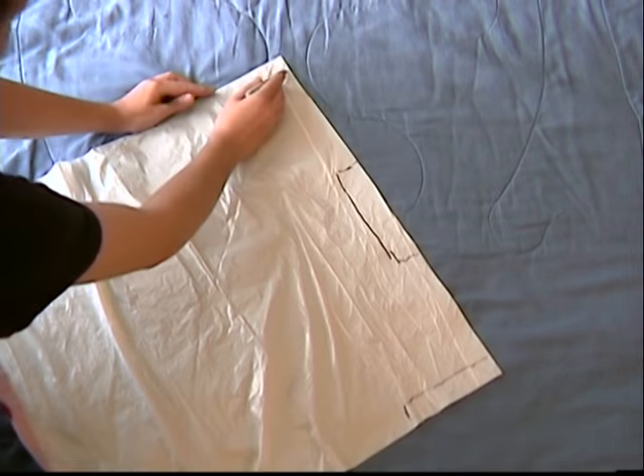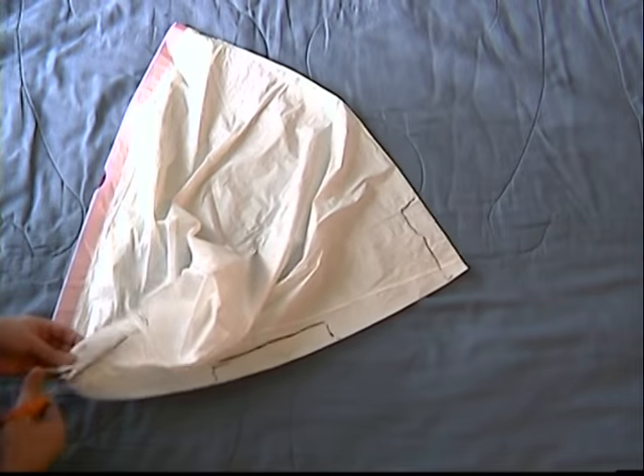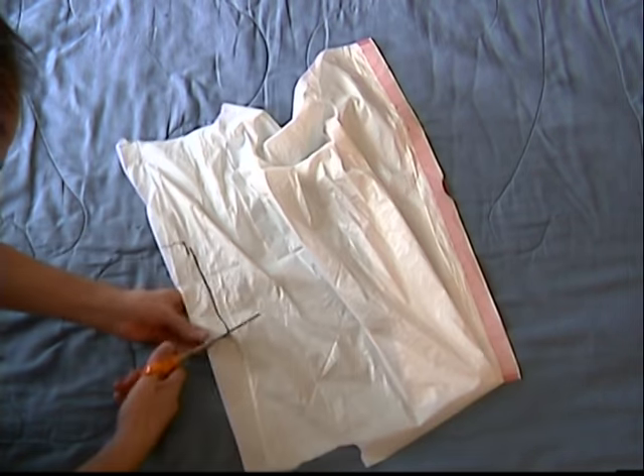We begin by turning the garbage bag into a medical vest. We are going to cut 3 small rectangles for the neck and arms, and use the main opening for our waistline.